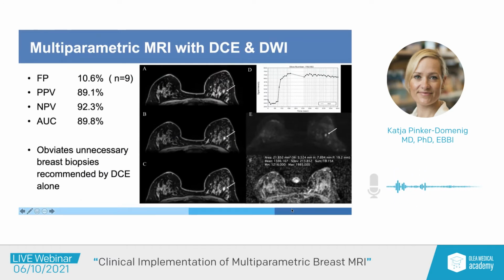In general, this was a patient who had a small, tiny, partially irregular mass. And in that case, she had an ipsilateral cancer somewhere else in the breast, in a different quadrant. This is sort of a dilemma. The patient had a cancer but wanted to go for breast conservation, so in this case we biopsied based on that. But from a diffusion point of view, we wouldn't necessarily have biopsied if we had encountered that in a single lesion setting, and diffusion-weighted imaging said that this is a benign lesion. That actually was it.